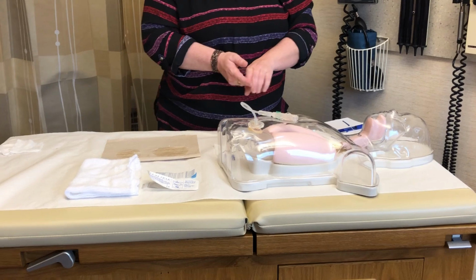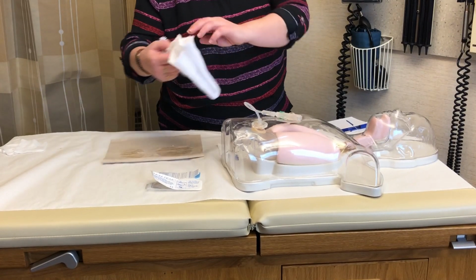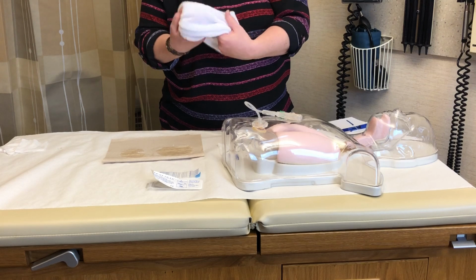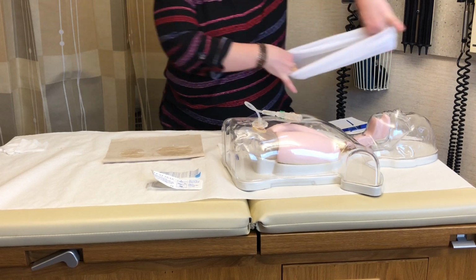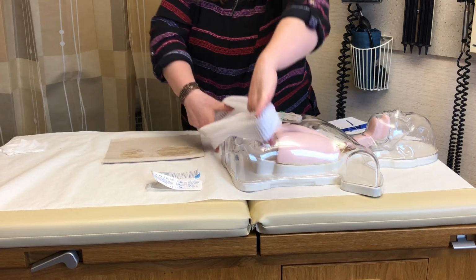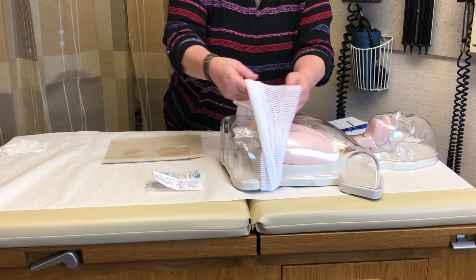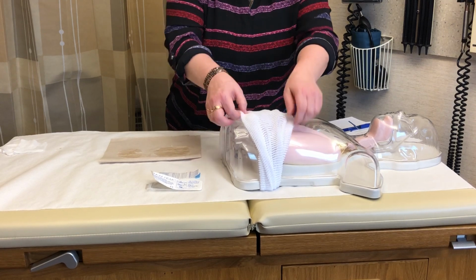Last thing we're going to do is secure the tube. Two types of securement devices that we use here in Rochester: the CPRONet, which can either be pulled down over your head and shoulders or up over your legs, and goes all the way around your abdomen and holds the tube in place that way.